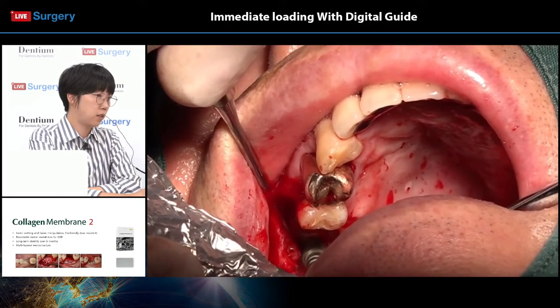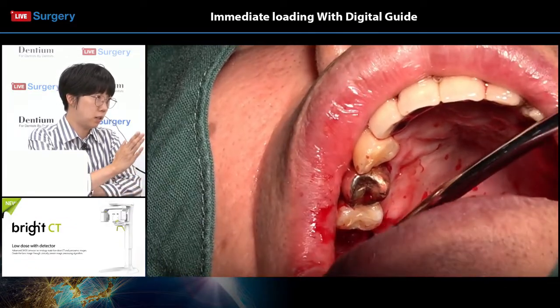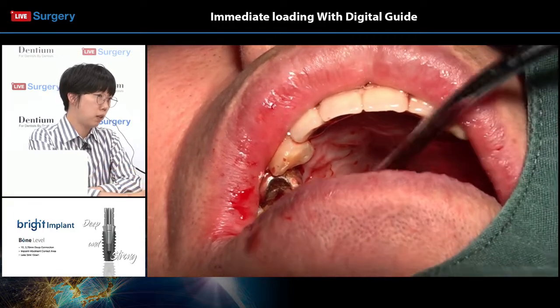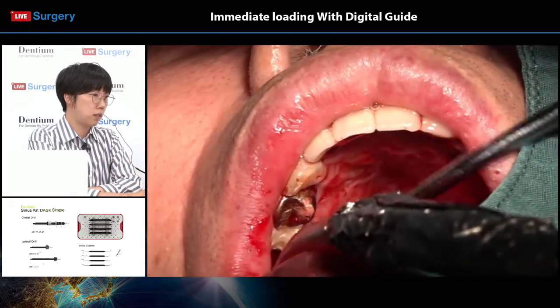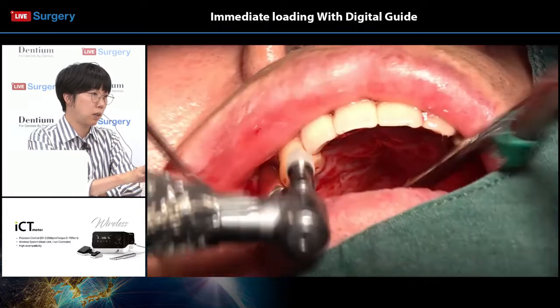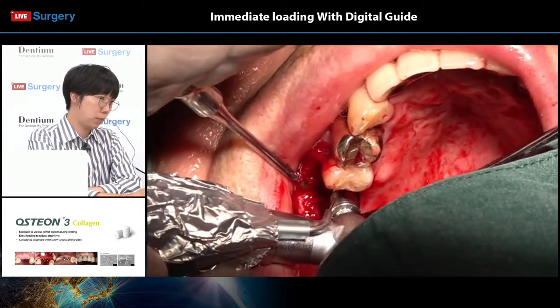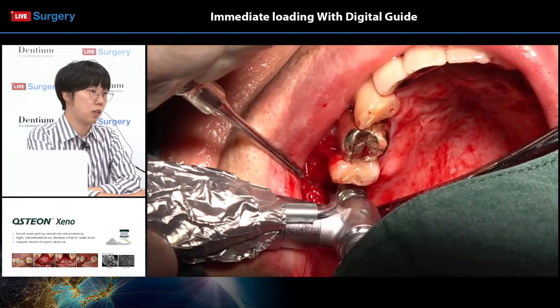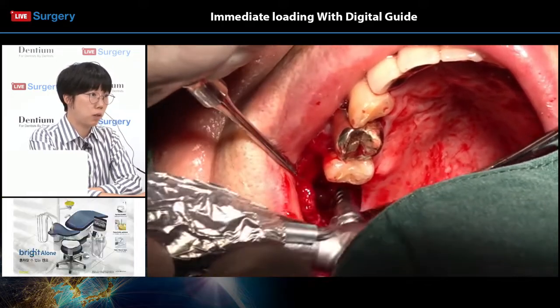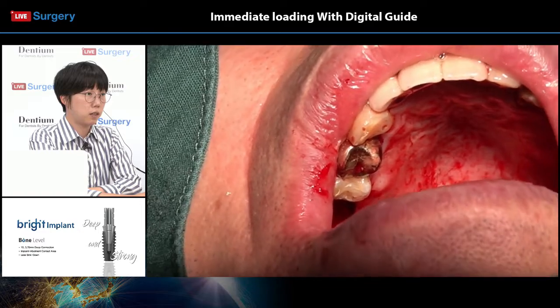So in this case, I think Dr. Lee has decided that the implant positions were too buccally deviated, so there won't be enough bone on the buccal side, or maybe there wasn't enough initial stability in the site. So in this case, he will probably have to change or switch positions slightly within the prepared bone housing, or to enhance initial stability, he'll have to increase the implant diameter. I think he has actually increased the implant diameter size. He is placing an implant with a diameter of 5.0 on the tooth number 16 area. The length of the implant is 8 millimeters.